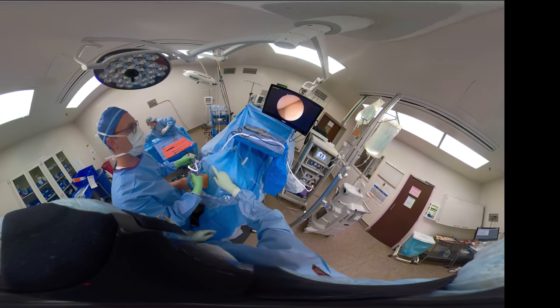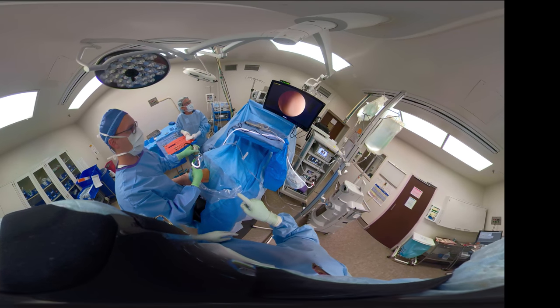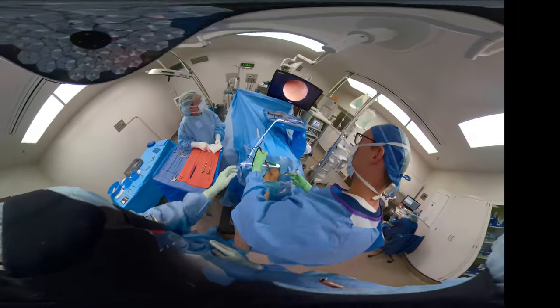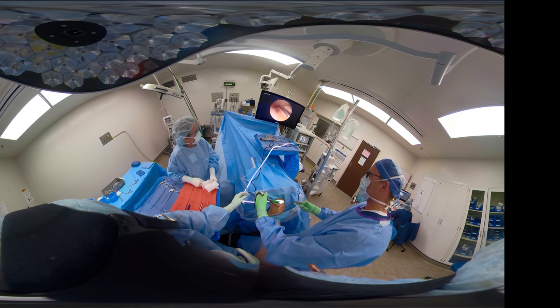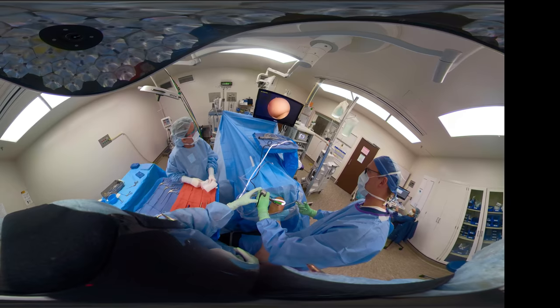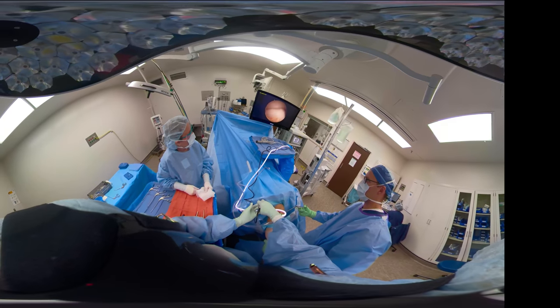So now we found that loose body in the medial gutter. So we have the scope lateral, and we're going to get the loose body out by grasping it. You can see the Schlesinger grasper is in that medial portal of this right knee. And we want to make sure we have a really good bite. There are no ratchets on this grasper, so he's holding the grasper very taut.